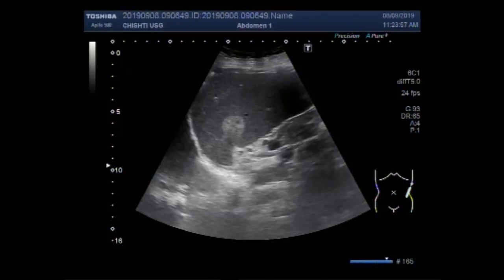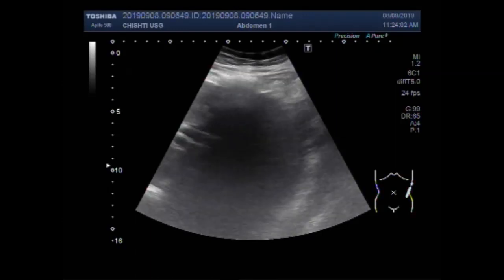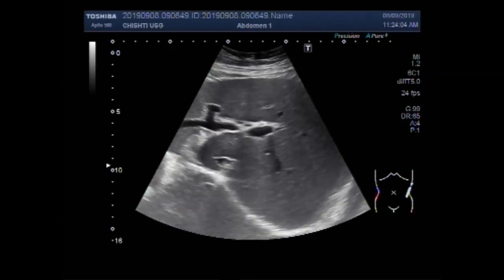Dear viewers, I hope you are all fine. This ultrasound video shows a focal region in the spleen.